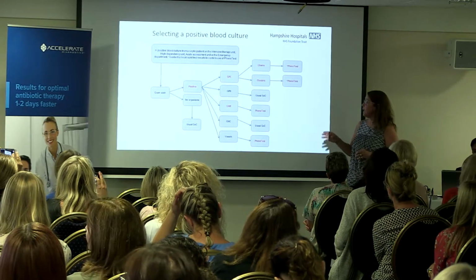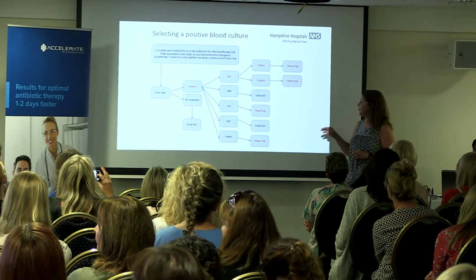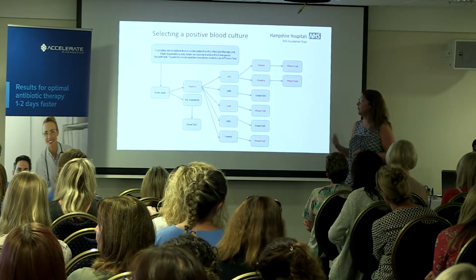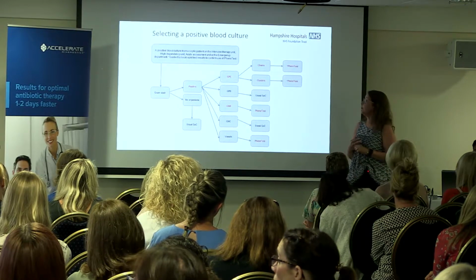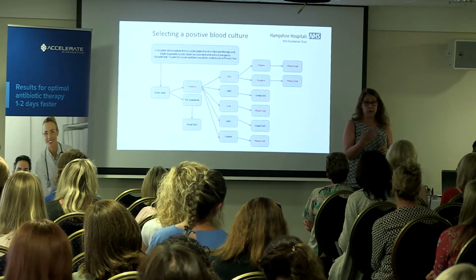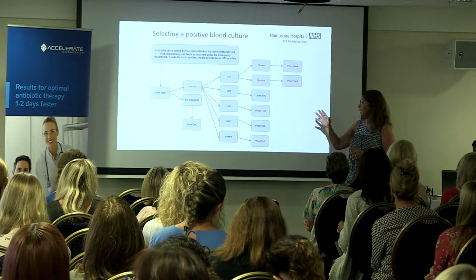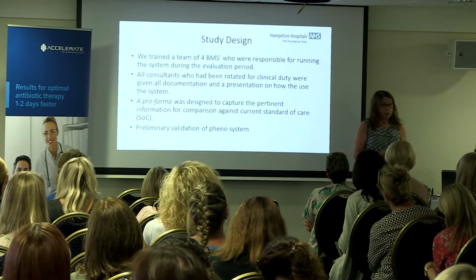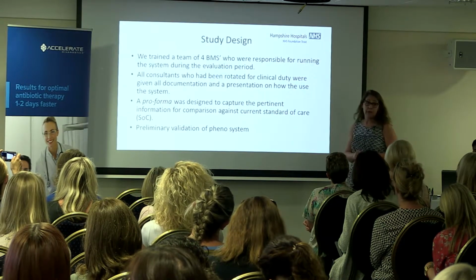This shows mainly that for gram-positive cocci, gram-negative rods, and yeasts, if it fit with the patient's needs, so if they were on the intensive care unit or our HDU, or they were from the emergency department or the acute assessment unit, or if it's another patient that we thought was sick, such as a neutropenic hematology patient, we would put them through the Pheno system, and otherwise we would just culture them as normal. We trained a number of our BMSs to use the system, which they found quite straightforward.